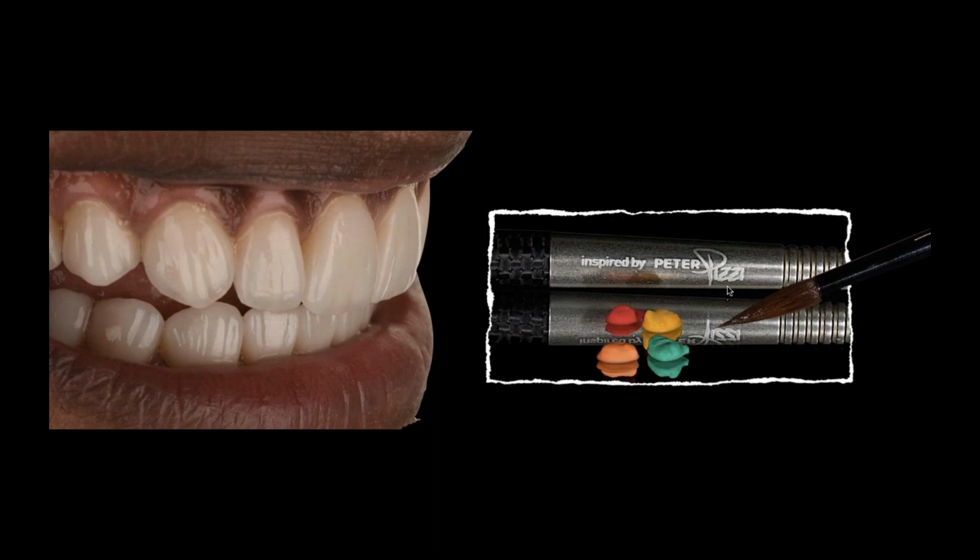Do you always glaze, or do you sometimes just polish? I always glaze, but I'll be honest with you, I almost feel like it's goofy sometimes that I glaze, because I wind up glazing and rubber wheeling the whole thing kind of away anyway. I glaze with a different perspective. For me, I glaze because if there's any microporosities or anything on the crown that I'm not really seeing with my eye, I'm really using a glaze, a very thin paste, or sometimes powders that I'm kind of flushing on my tooth, and I'm really doing that to fill all the microporosities and keep it more sealed. But at the end, I'm going to break a lot of that glaze away, and then I'm going to polish the surface.